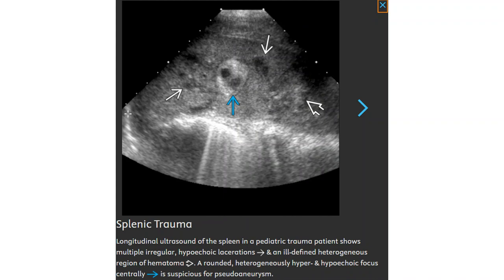This is the ultrasound of the spleen in a pediatric trauma patient, showing a laceration and an ill-defined heterogeneous region of hematoma. A round heterogeneously hyper- and hypoechoic focus is suspicious for pseudoaneurysm.